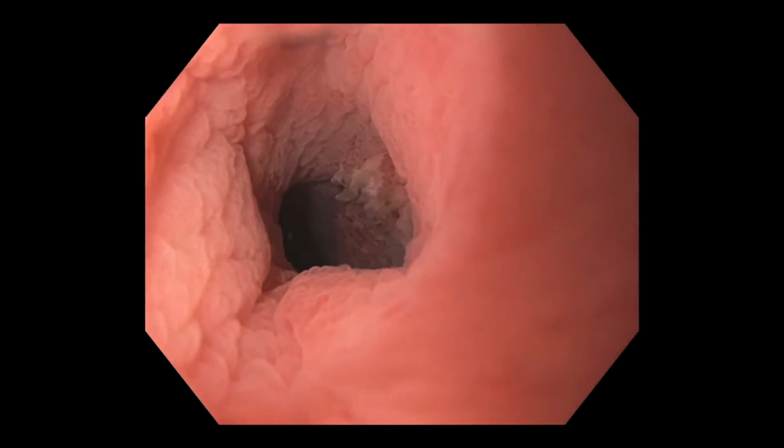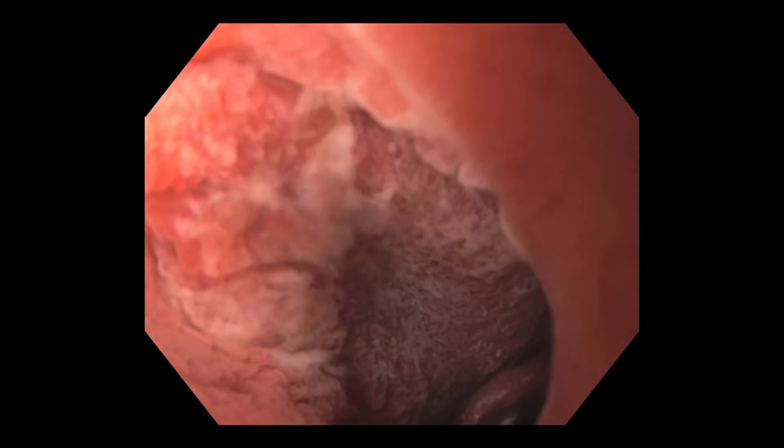Repeated attempts at biopsies of the stricture on prior colonoscopies did not yield dysplasia. On this examination, continuous water infusion helped to distend the stricture, allowing better visualization of an ulcer and targeted biopsies of the abnormal dysplastic appearing area. Biopsies confirmed carcinoma.